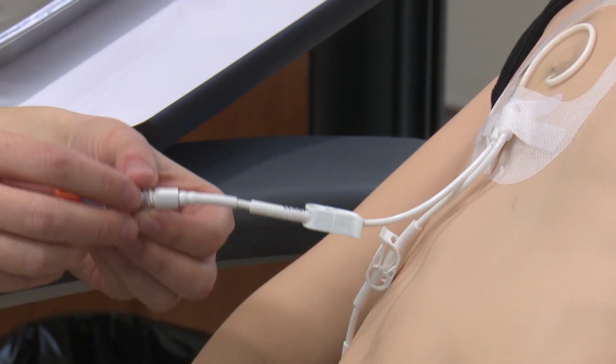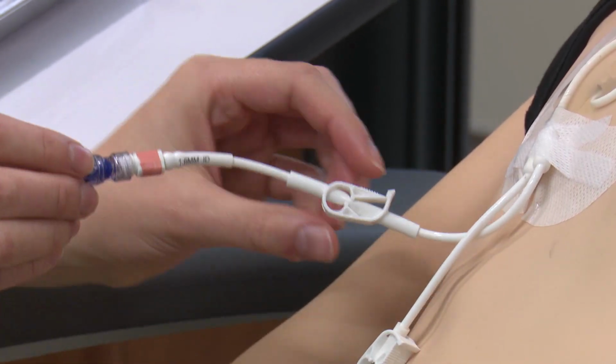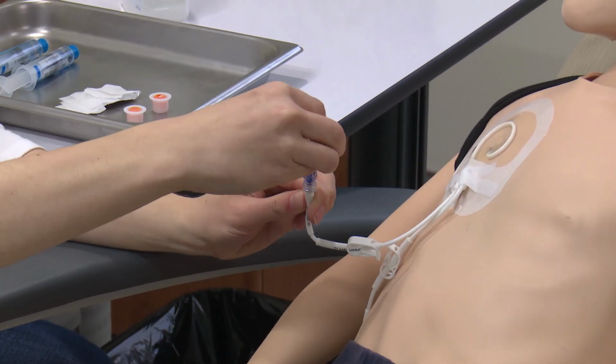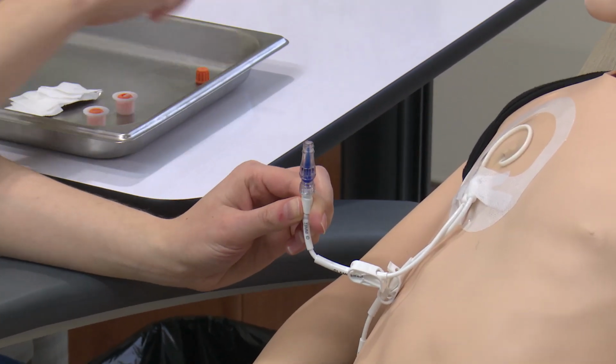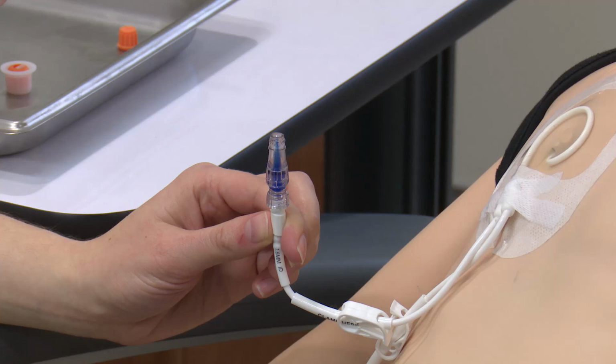Look at your child's central line and make sure each lumen is clamped. If there is a swab cap, also known as a pumpkin, on the end of the lumen, remove it now. If the swab cap has stayed clean, has not been dirtied, and has been on for longer than 5 minutes, you do not have to scrub the cap. If you think the swab cap may have become dirty, for example, if it came off and was placed back on the cap, then it is important to follow the next steps and clean the cap.